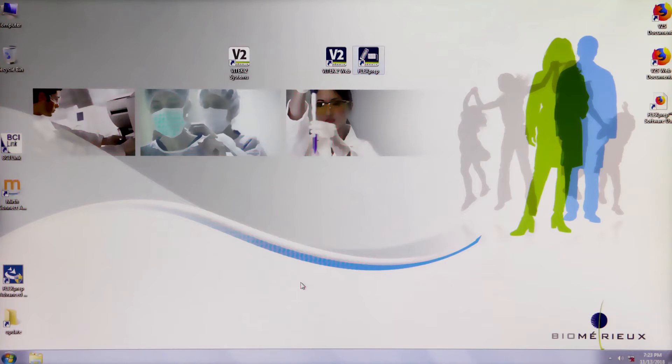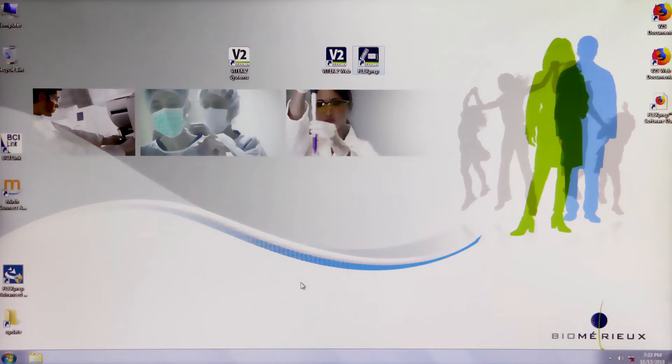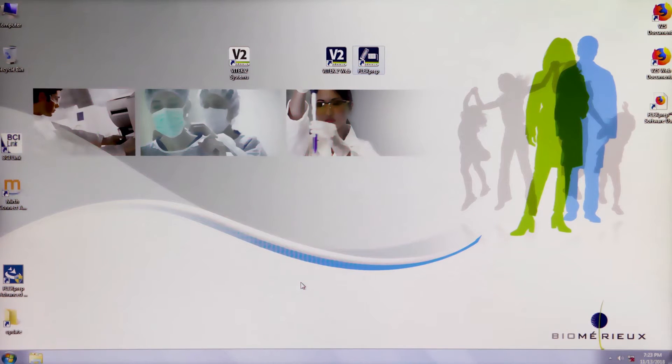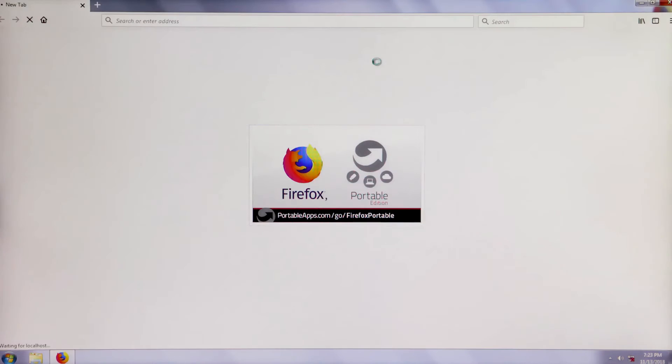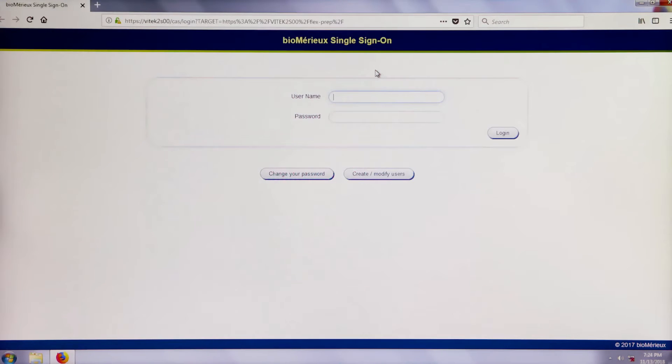Vitec2 customers can define cassettes prior to loading a cassette in any of the Vitec2 system's instruments. To create a Vitec FlexPrep cassette, log into Vitec FlexPrep by double-clicking the FlexPrep icon on the computer desktop.